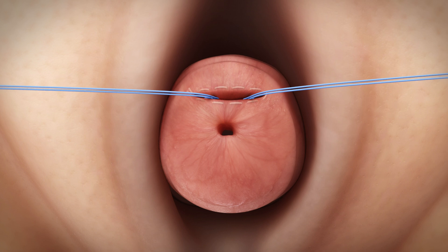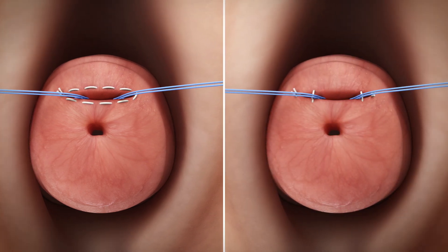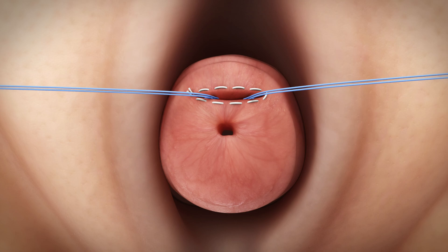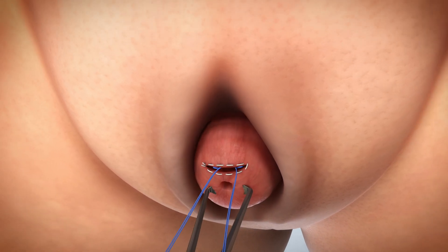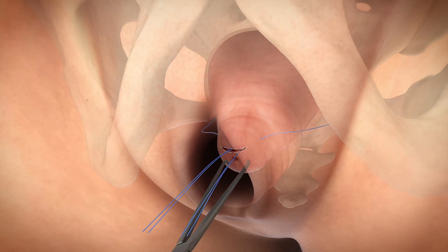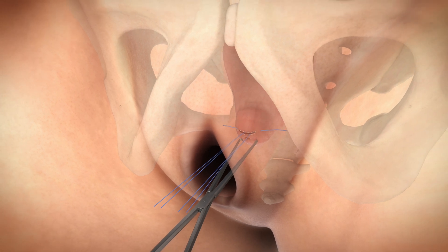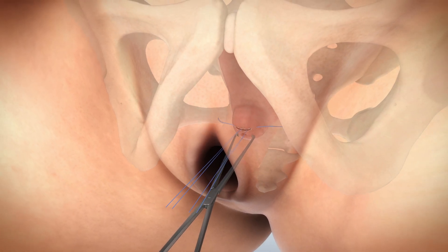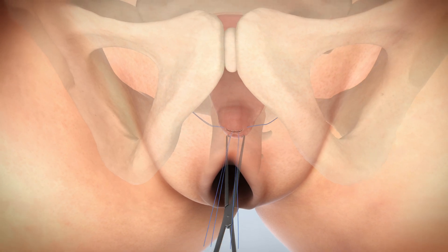Use a zero to two vicryl suture. One may use a purse string or two individual sutures as the approach to preplace closing sutures, as the incision will be further away after suture tensioning. Push the cervix together with uterus and vaginal vault inward with an alice or similar instrument and slide it along the sutures, maintaining tension on the sutures by holding them with an alice clamp in your opposite hand. This step ensures there is no hidden slack in any of the sutures.